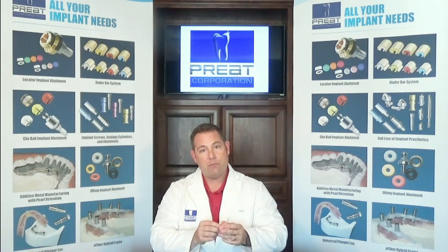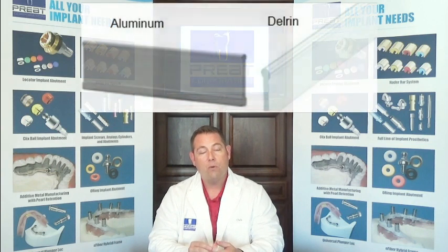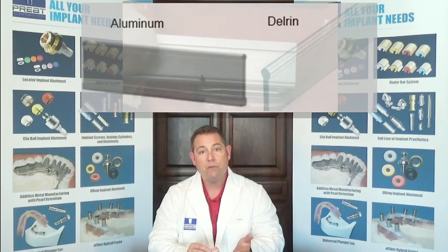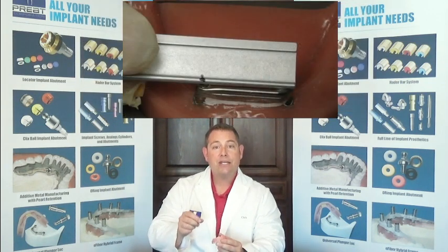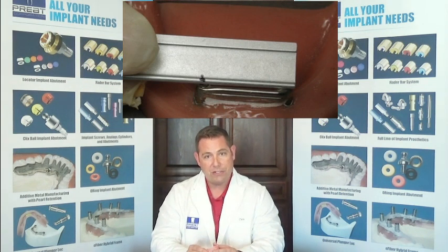Once we've taken that impression, there are two different analogs we can use. One is an aluminum analog. The aluminum analog is more sturdy and can be reused if you like. You take a disc, cut it into sections, and snap it into the clips inside the prosthesis.